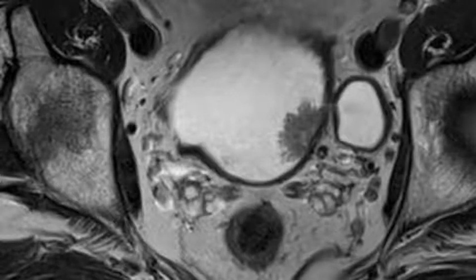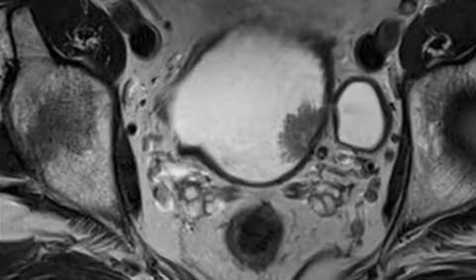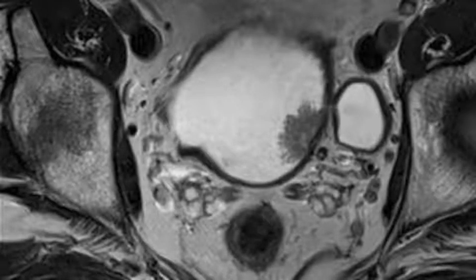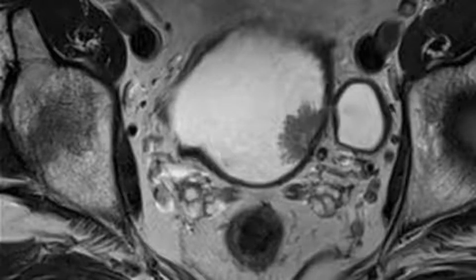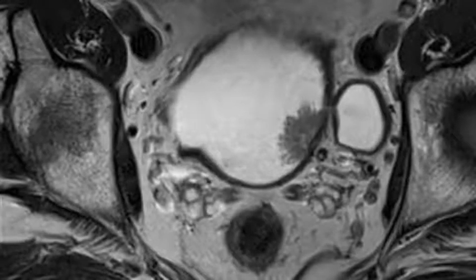In lymph node staging, CT has an accuracy of 70 to 90% with false negative rates of 25 to 40%, whereas MR imaging has an accuracy of 64 to 92%. Conventional CT and MR imaging cannot help identify metastasis in lymph nodes less than 10 mm. Enlarged nodes may be reactive, so that specificity is also limited.